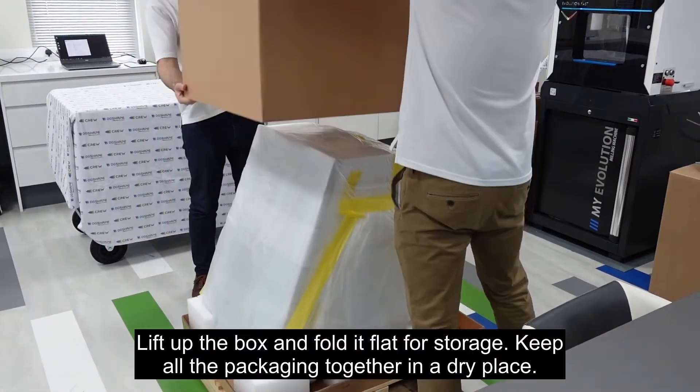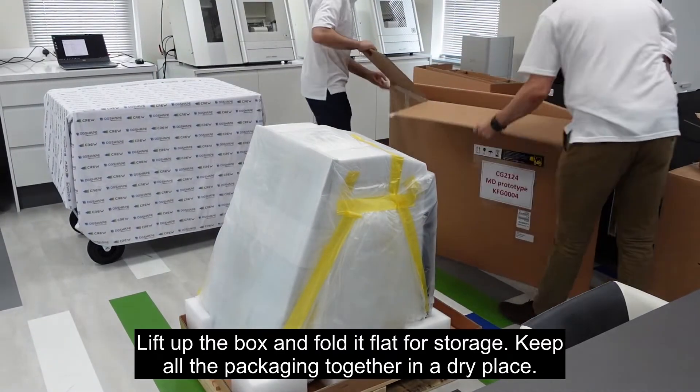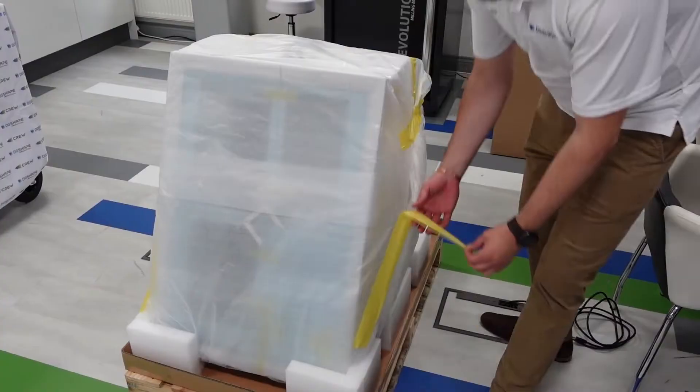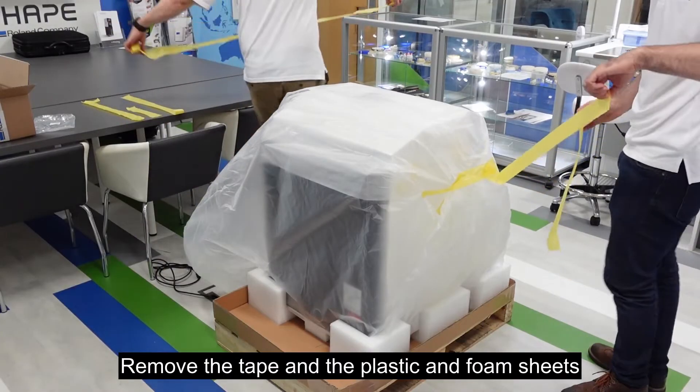Lift up the box and fold it flat for storage. Keep all the packaging together in a dry place. Remove the tape and the plastic and foam sheets.